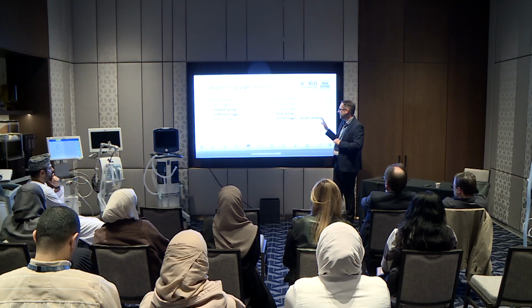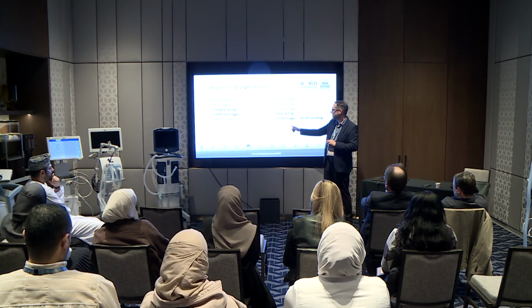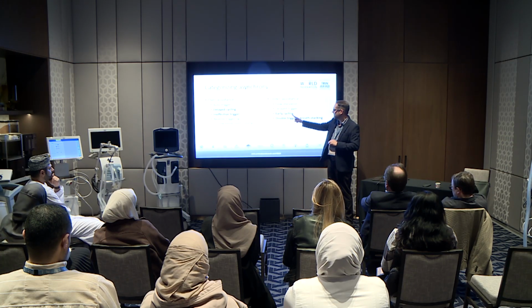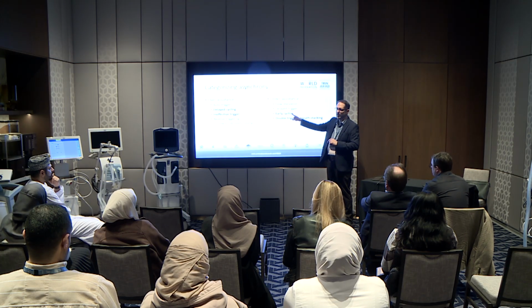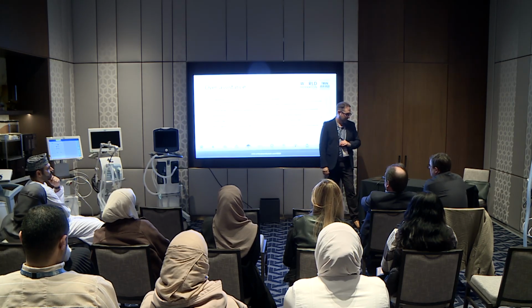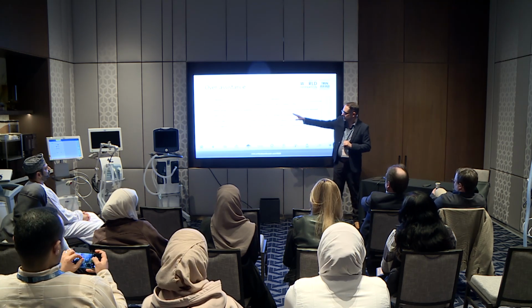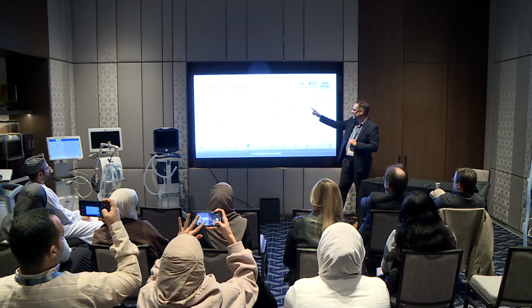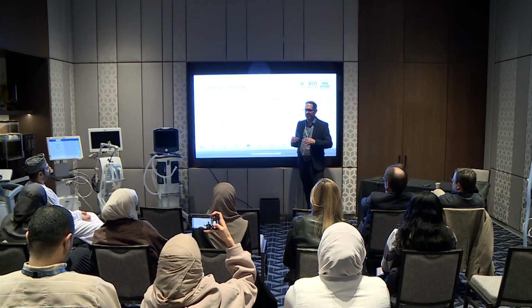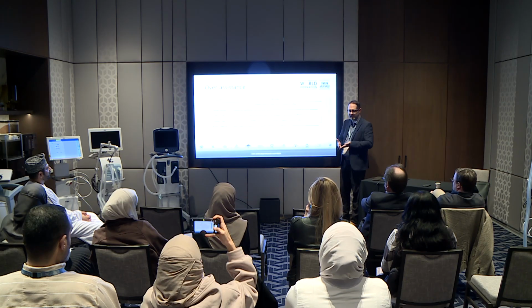And then double trigger, of course, and breath stacking. The patient is taking one breath, the machine cycles off, so they have early cycling, and then it triggers a second breath. So this causes this, but you can also have early cycling without the result of breath stacking. And we'll see picture examples for all of this. So for auto triggering, the ventilator pressurizes without inspiratory effort. Delayed cycling, the mechanical insufflation by the ventilator continues after the neural inspiration has ceased.